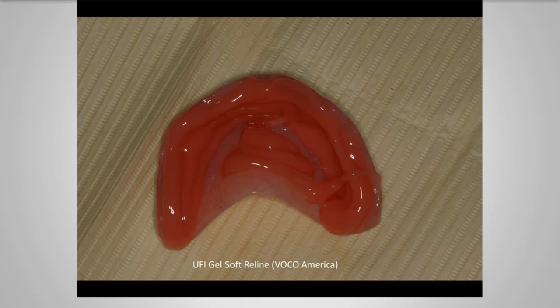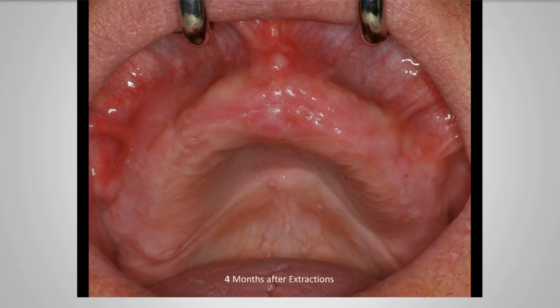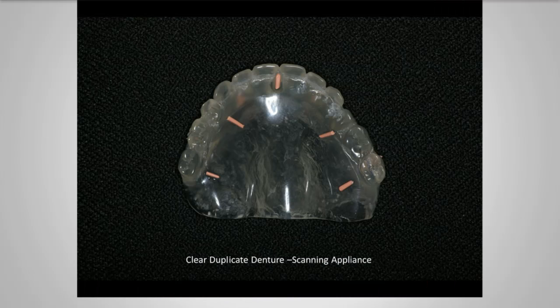Here there was a question earlier about the type of membrane that I like to use. This is the Conform membrane from ACE. Dynamatrix is another one that's very good from Keystone. Zimmer has another good one. There's a variety of great membranes that are out there.